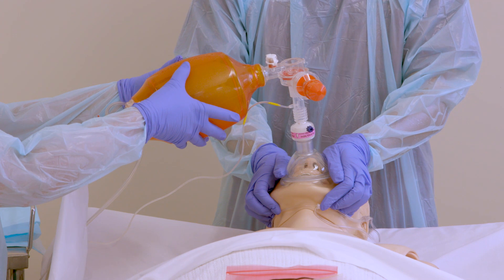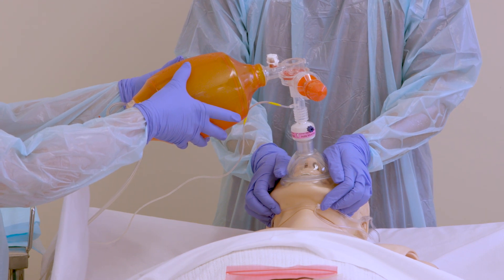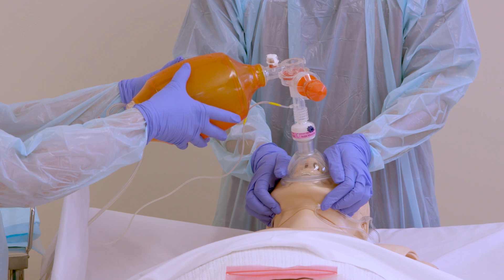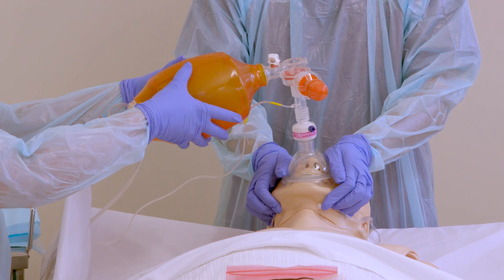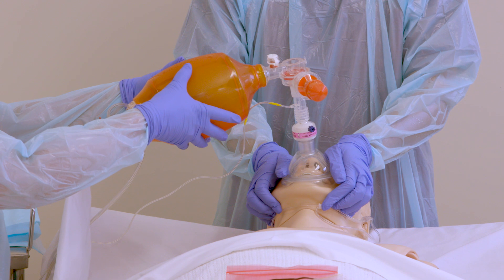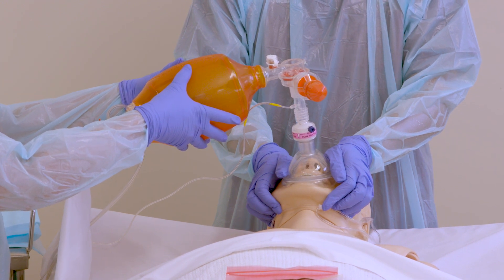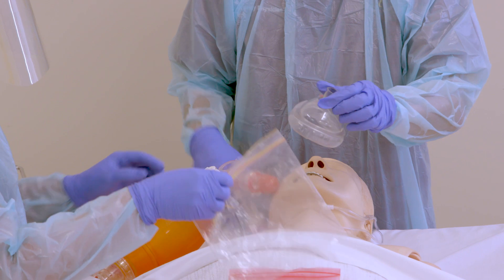Administer the induction drugs and high-dose paralytic. Continue holding the BVM mask and do not bag. Tolerate the desaturation if it occurs. Wait for complete paralysis. Place the used face mask into a seal bag.